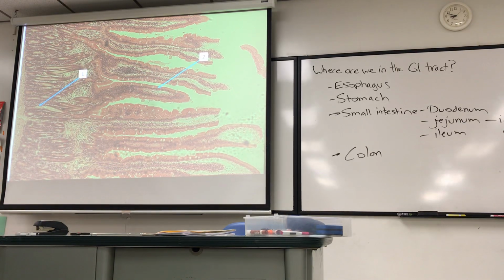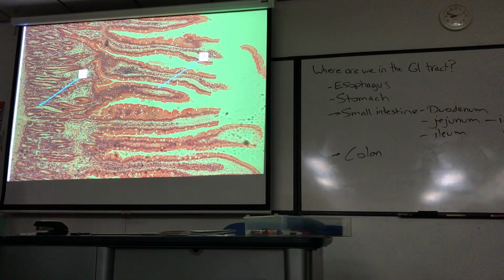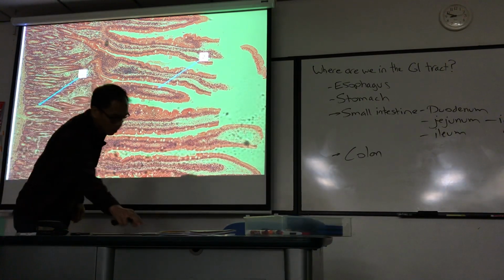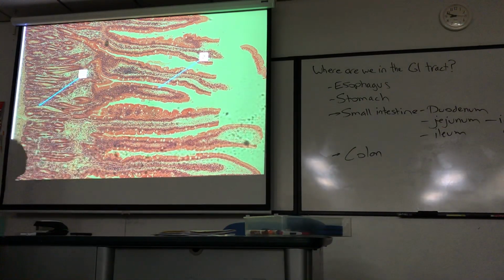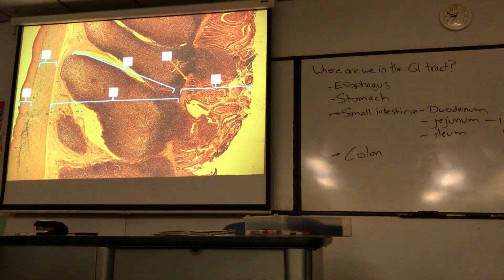Remember, the arrangement of the mucosa in the small intestine is its villi and crypts, right? So crypts are secreting things to help absorption. Let's move on from jejunum. This is just looking at the crypts of the jejunum, I should say. The reddish cells are considered the Paneth cells, and they're always there. They're always modeled or labeled. I'm going to move on from jejunum.